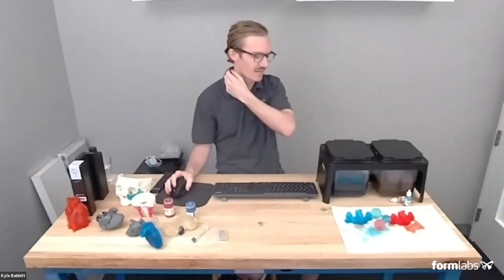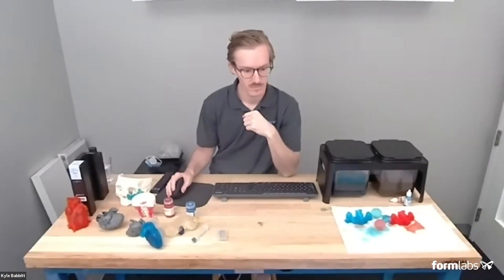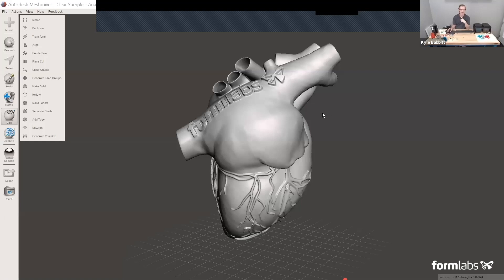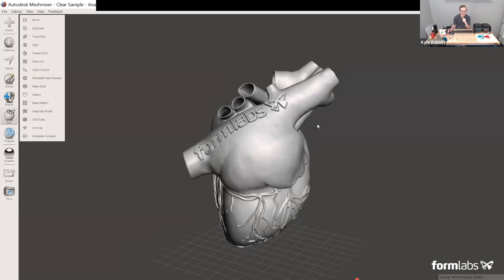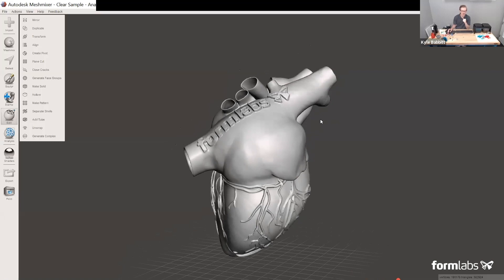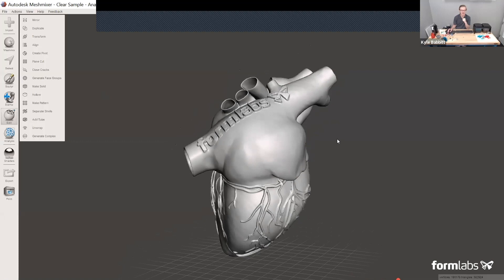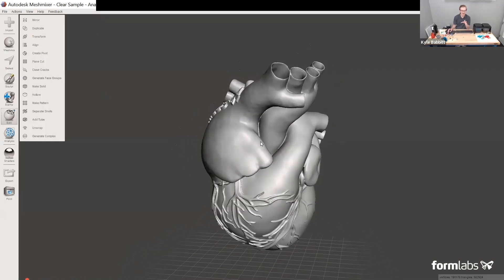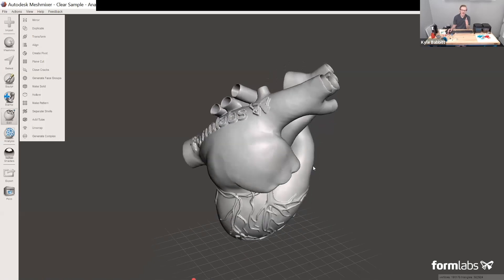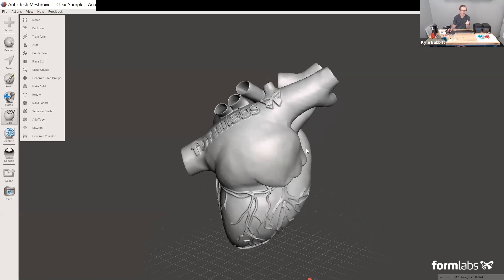Now I'm going to share my screen and go over some simple design tips for producing these advanced anatomical models. The program you see here is called MeshMixer — completely free. Some of the design features are a little limiting, but you can still produce high quality models using its simple tools. The first thing you'll want to do when bringing in a model from segmentation is clean it up — there's probably going to be a lot of noise. Remove anything you don't need to print to save time and money on material.